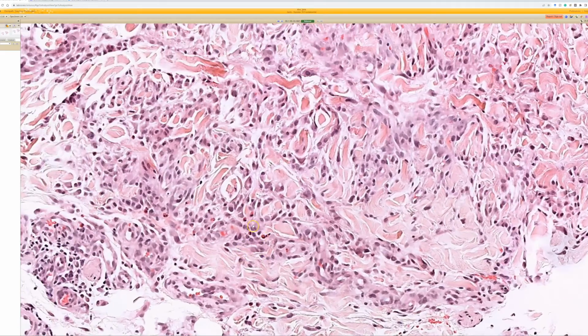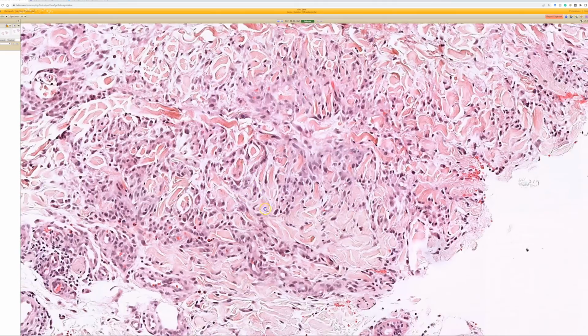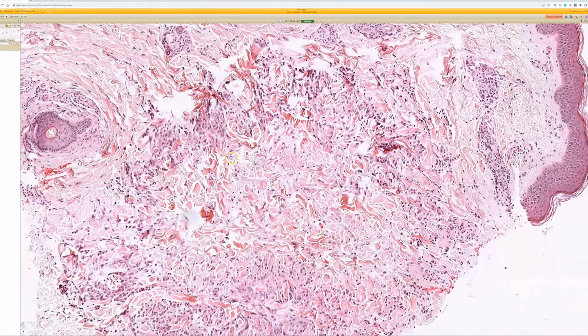Oh yeah, GA often has eosinophils. That's a common finding, actually. I don't feel like people talk about it a lot, but I often see EOs in GA. I think some people have found like 30% or so of GA have EOs.